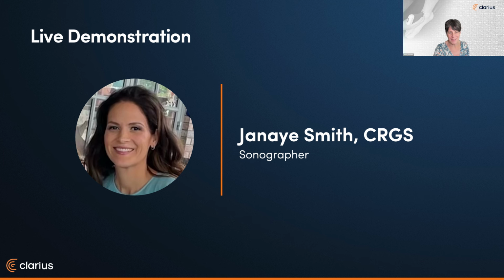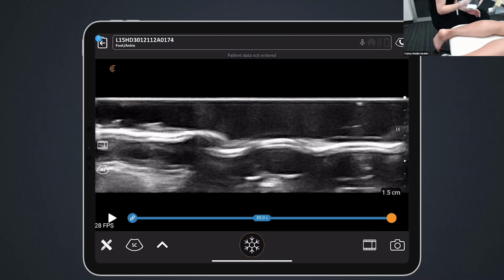Perfect. I would love to be at that boot camp, Mark. Okay, we're going to hand things over to Janae. She's going to give us a quick demo of the Achilles tendon and the plantar fascia using the same L15 that Mark was using. Thanks, Shelley.